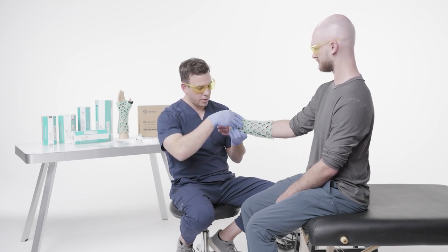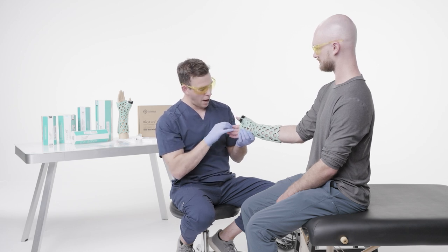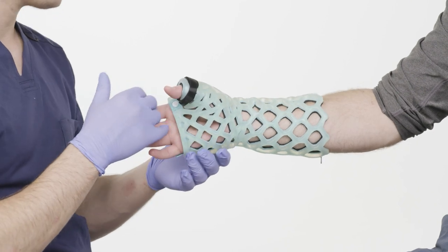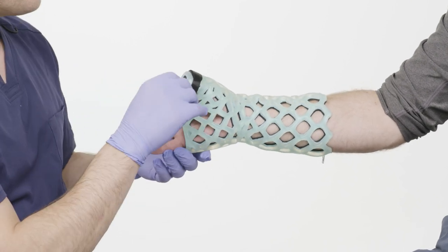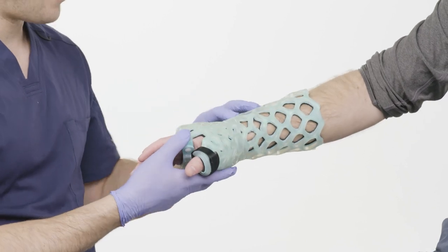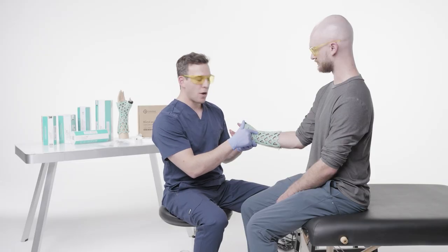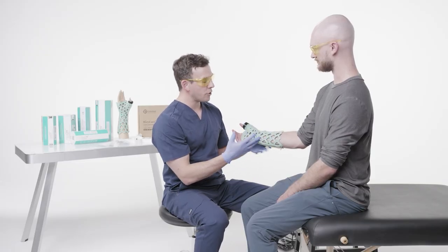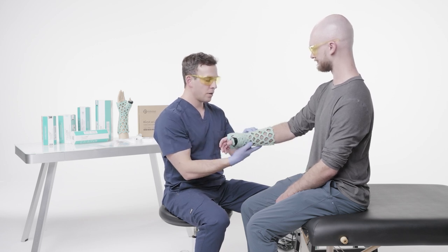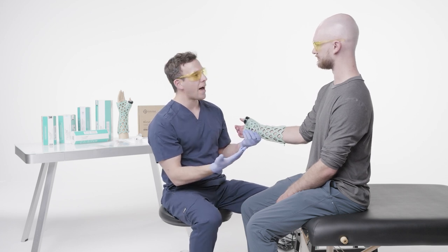The inspection looks good and it's applied. I'm going to do a cap refill check. Check dermatomes — can you feel that? Yes. Can you feel this? Yes. One great advantage of this brace over a regular fiberglass cast is that I can do my dermatome check inside where the brace is — I can check sensation through the brace, which you cannot do with a regular fiberglass cast.